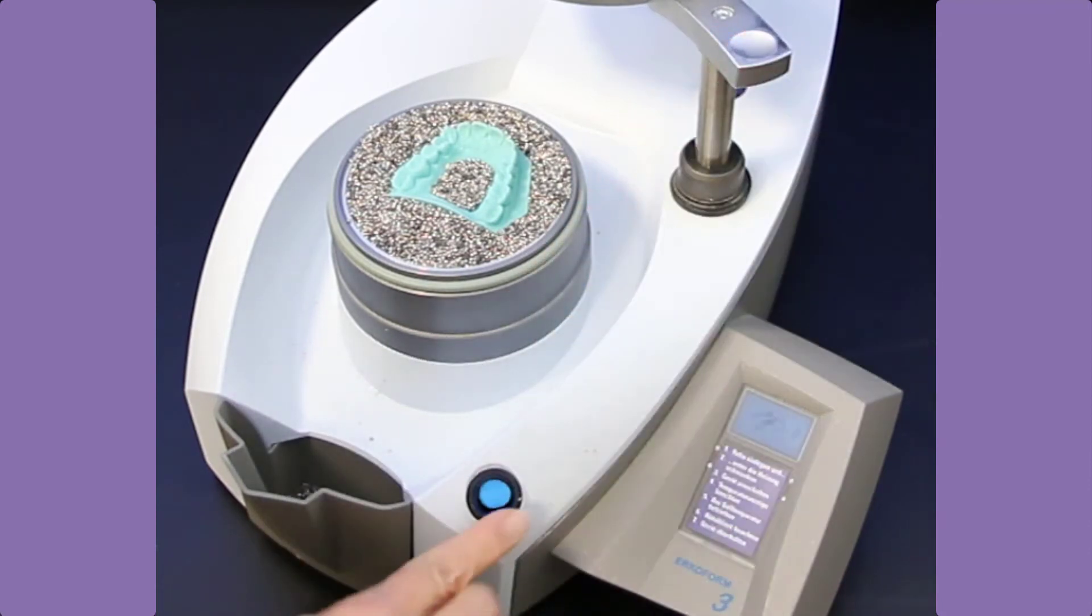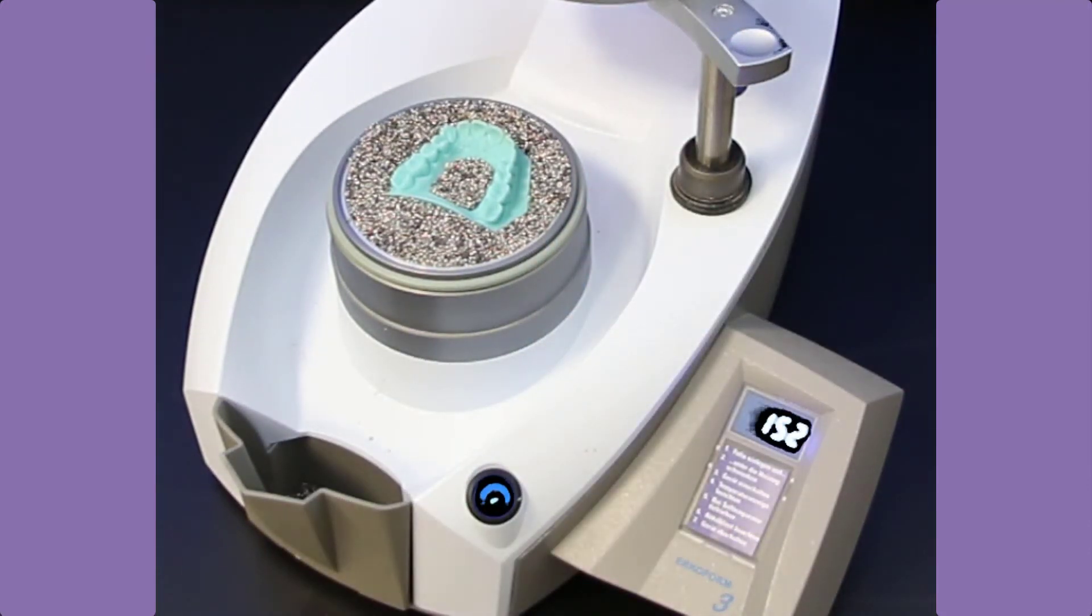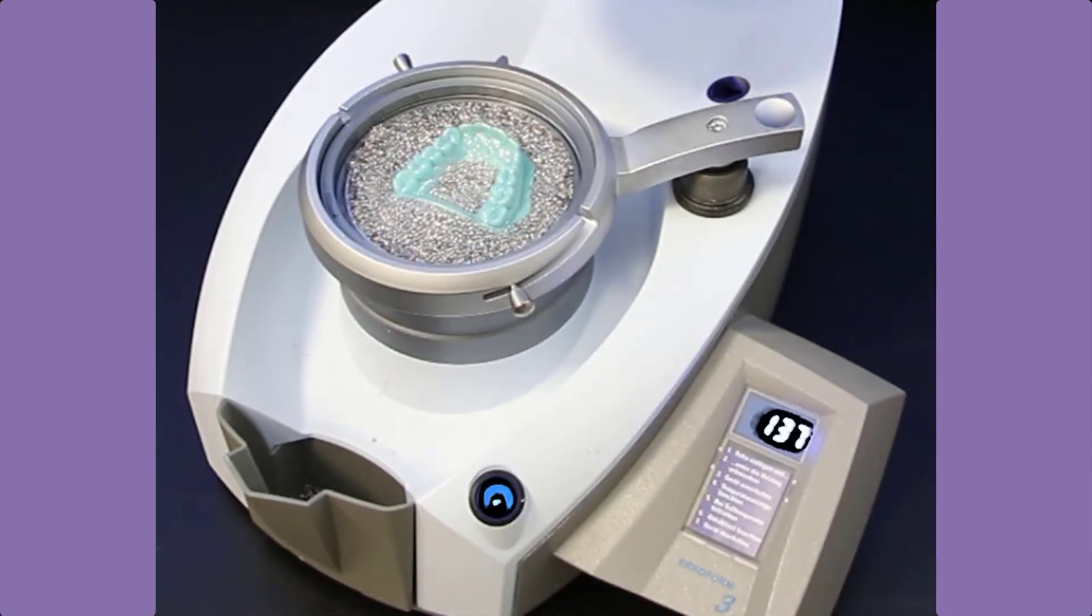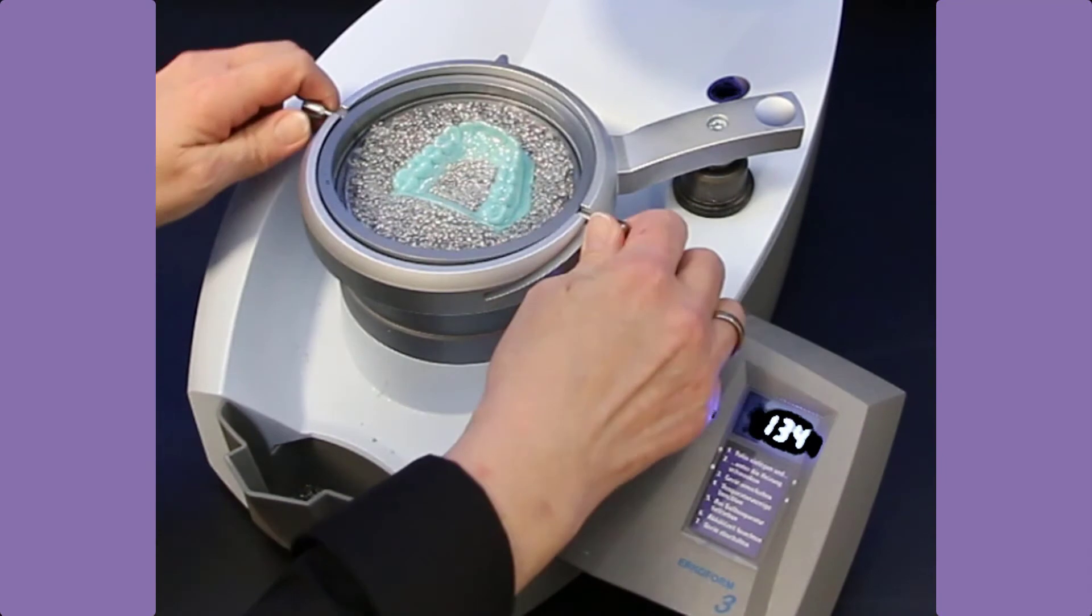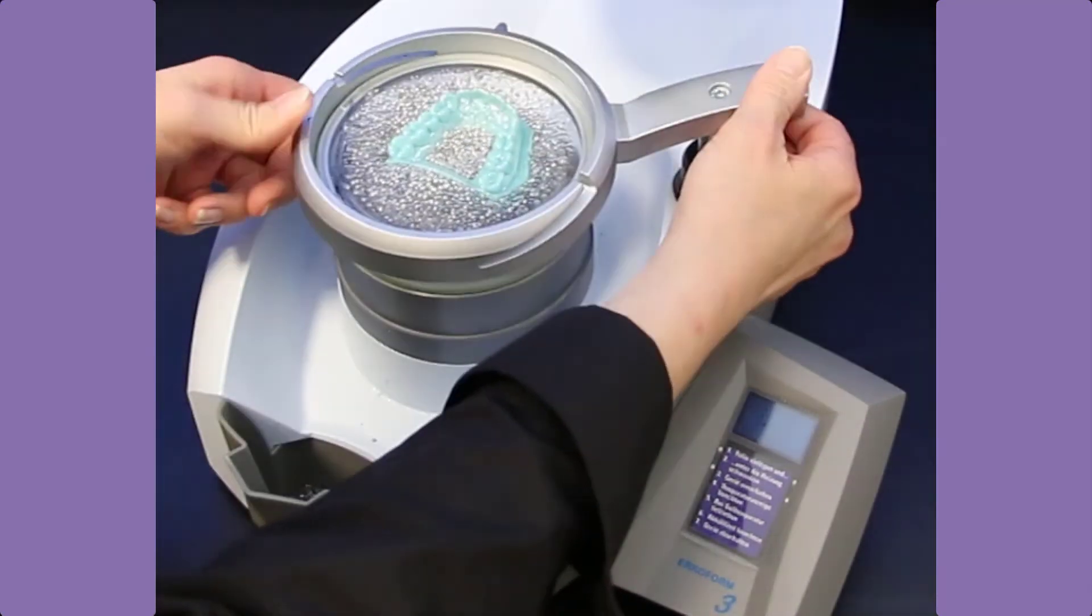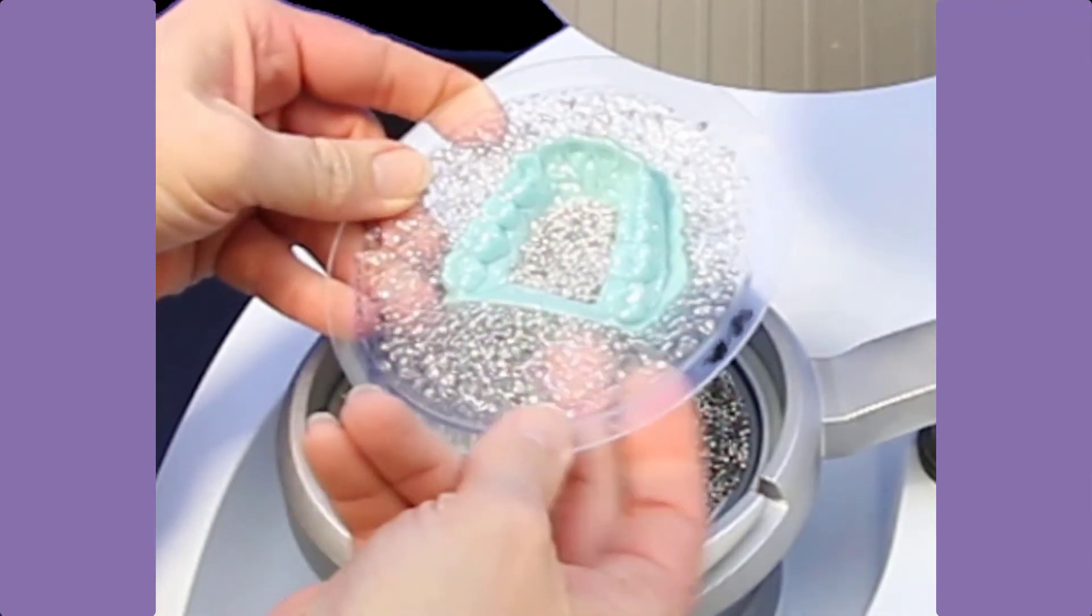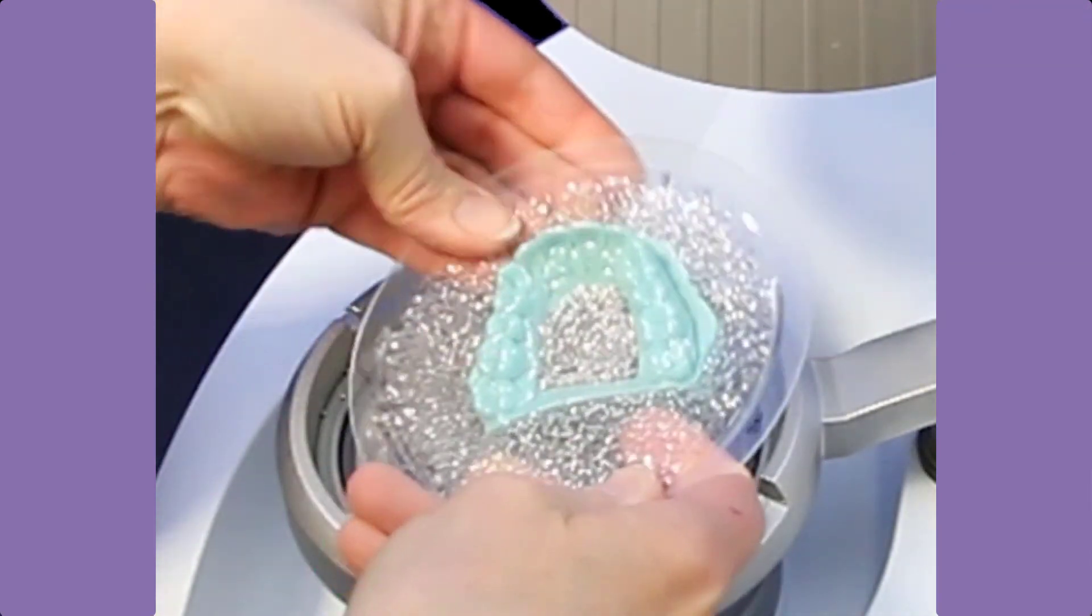Therefore, it is also suitable for the thermoforming technique and for aligner production. DEMA print stone teal can also be printed without hollowing at a maximum height of 15 millimeters. This means that no additional CAD software is required for the model production, and a quick and easy production of several models for, for example, the aligner technology is possible.